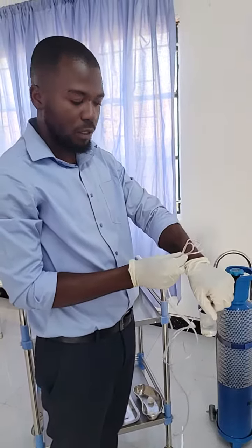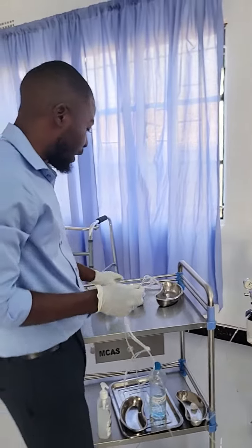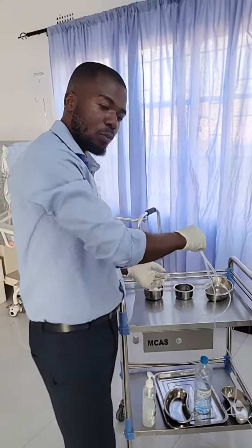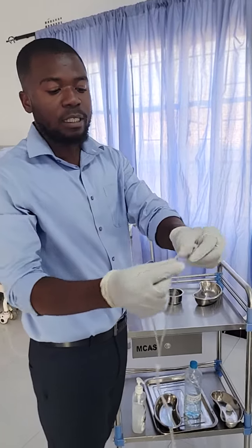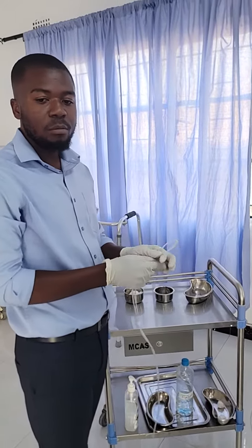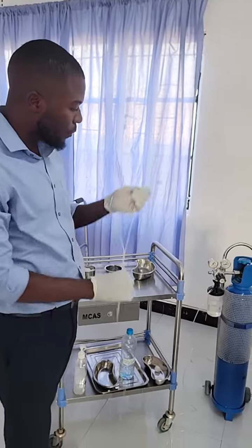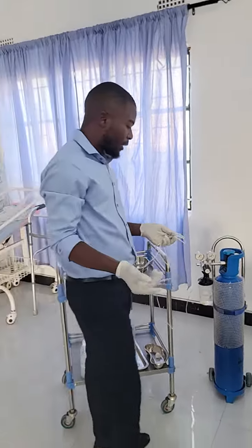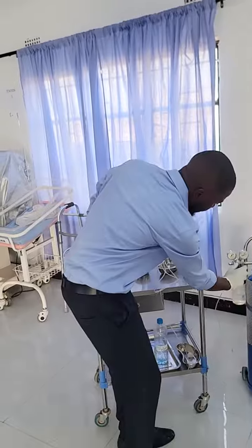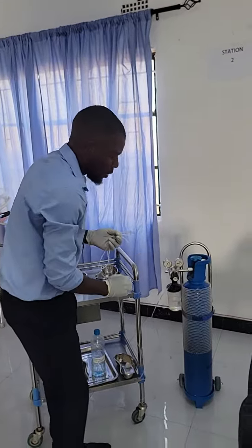Is it coming out? Yes. You can do this from here, or you can get normal saline and put this part inside the galley pot. If there are bubbles coming out, that means there is air coming. So if the doctor ordered you to give 4 liters or 5 liters, you have to regulate from here. Then you check from the flow gauge there.